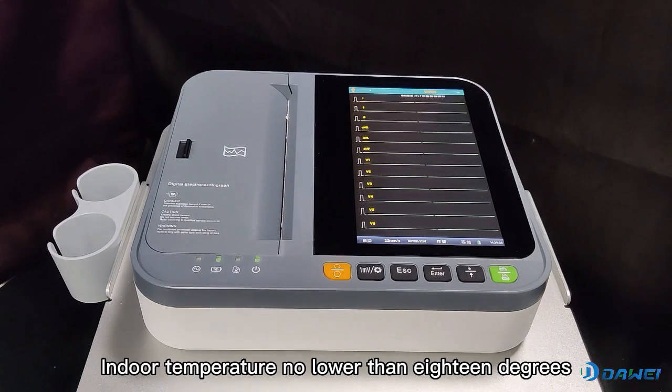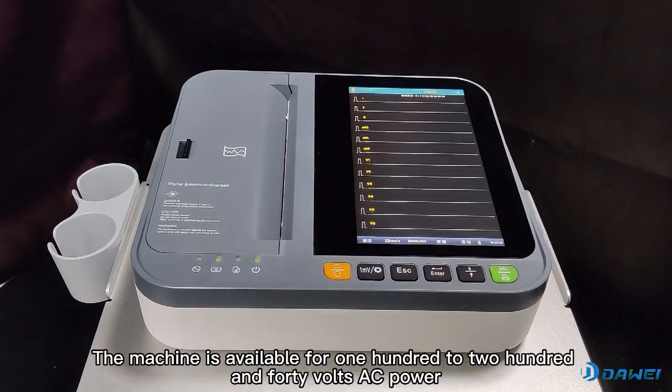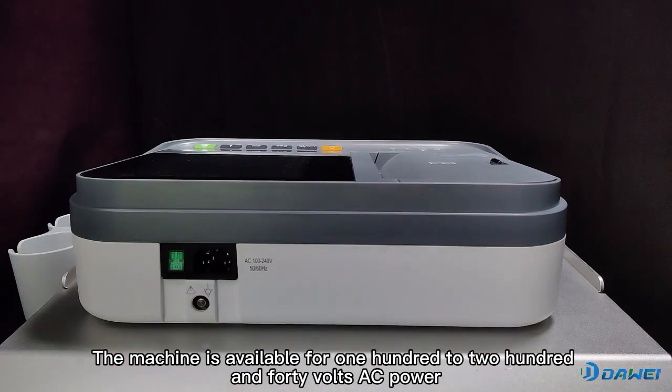Indoor temperature should be no lower than 18 degrees to avoid damage and interference. The machine is available for 100 to 240 volts AC power.